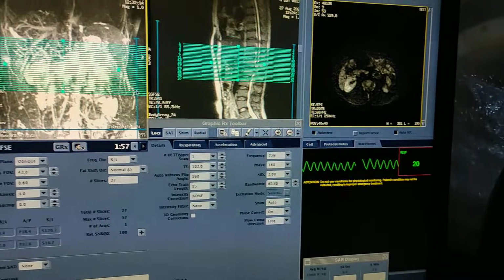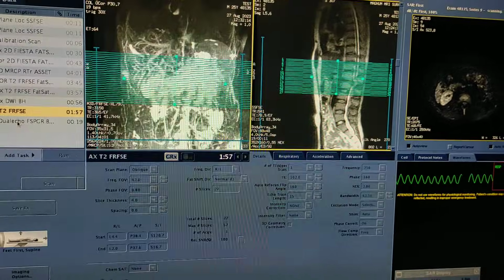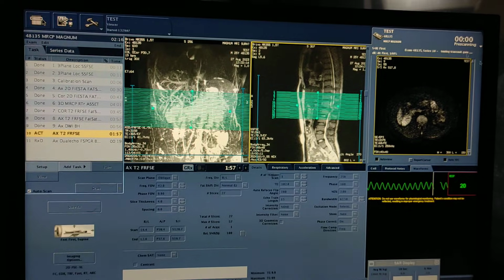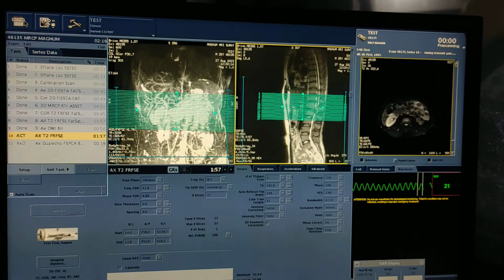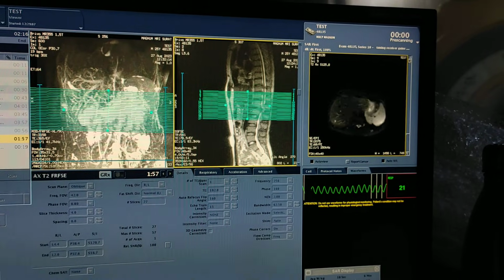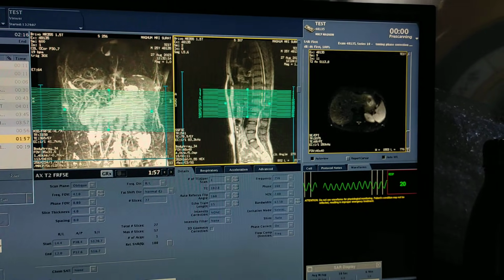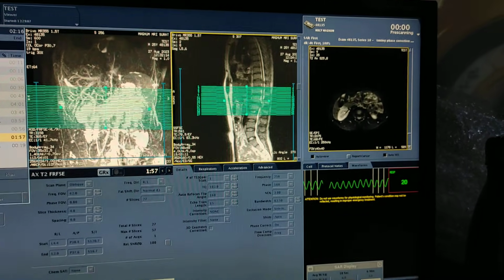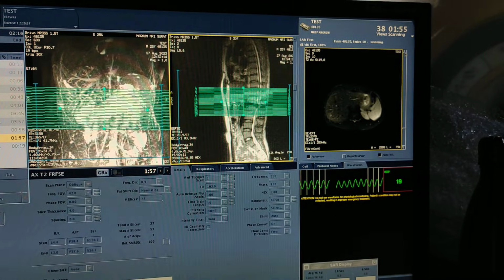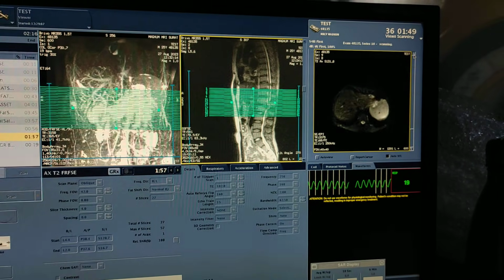Diffusion sequence is going on. Diffusion is taken just to rule out if there is some lesion in the liver. Sometimes there is a cholangiocarcinoma. You can see this tiny lesion in the liver, right, on diffusion, maybe some cyst or like that.